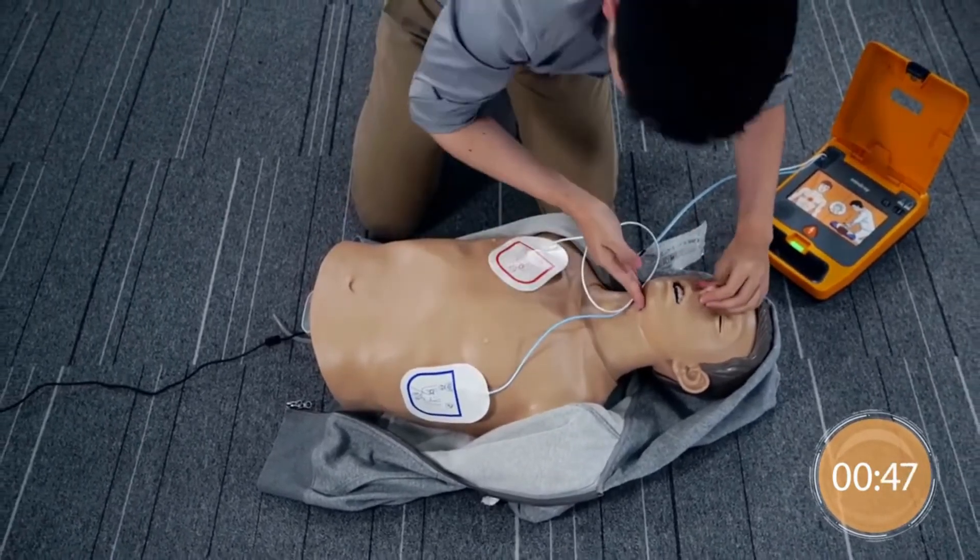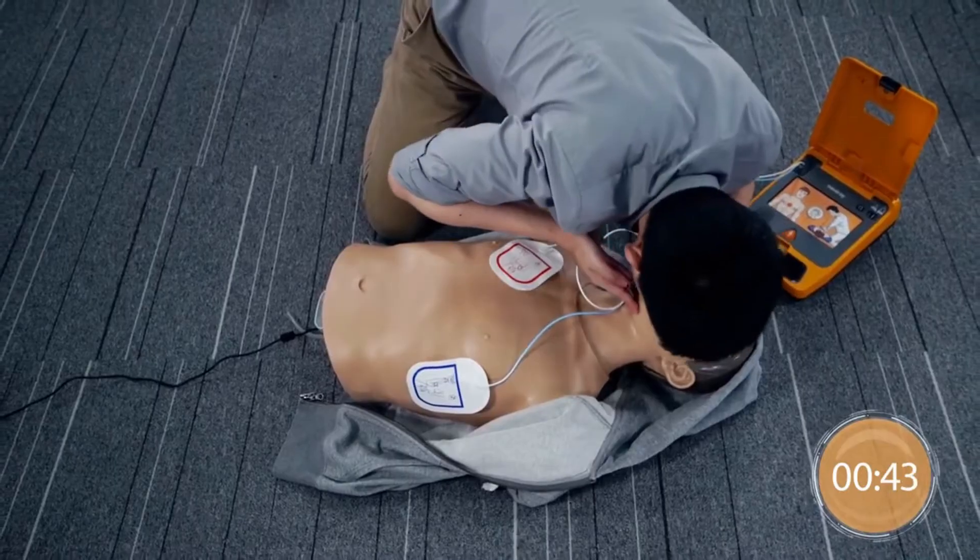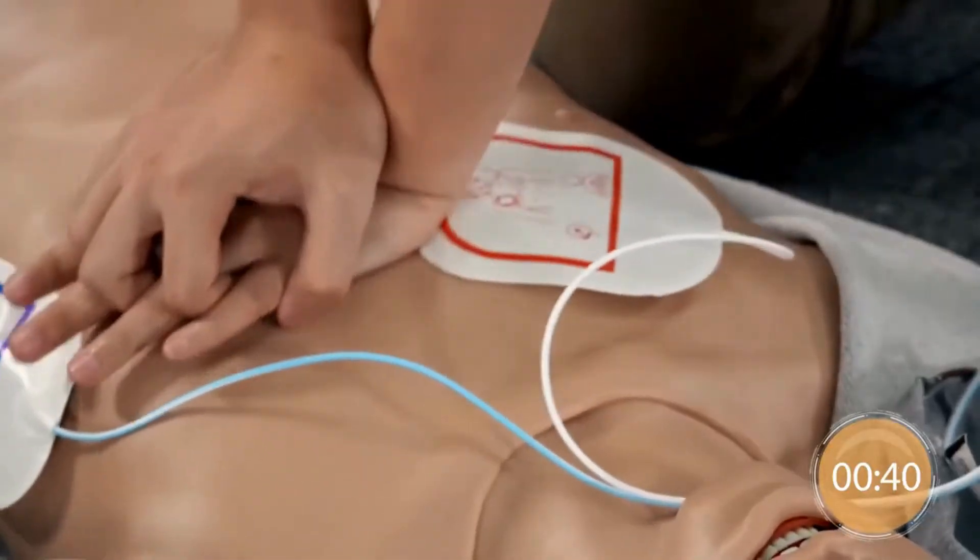Give 2 rescue breaths. Continue with compressions.